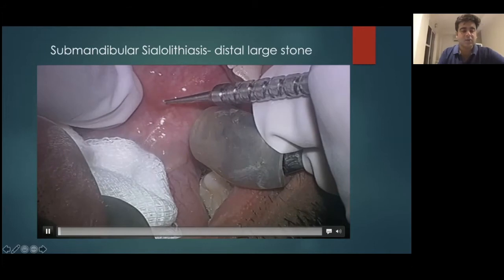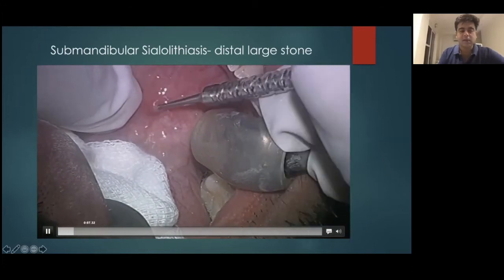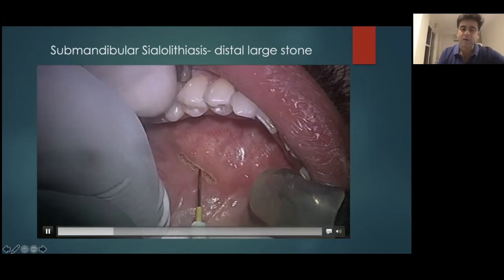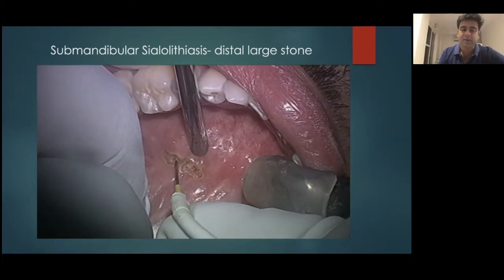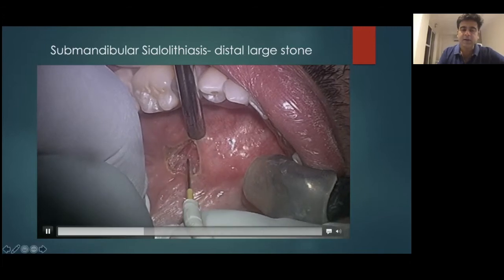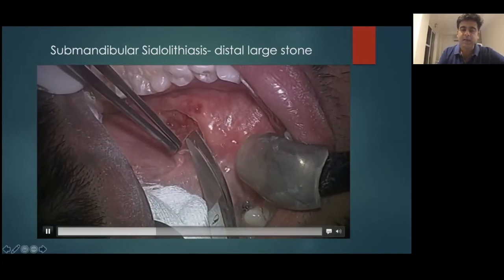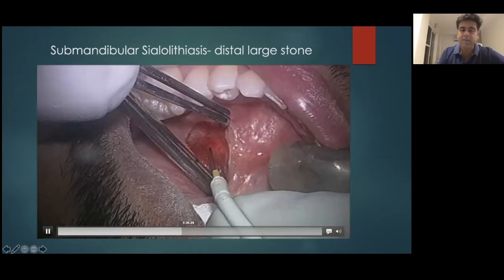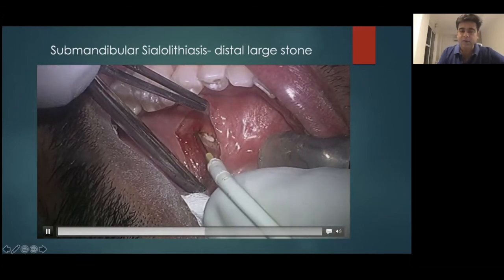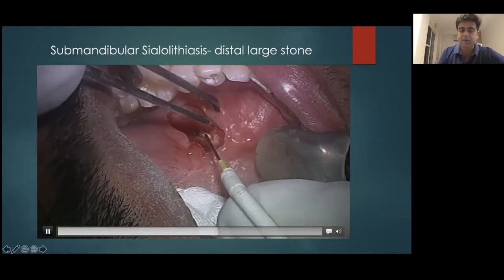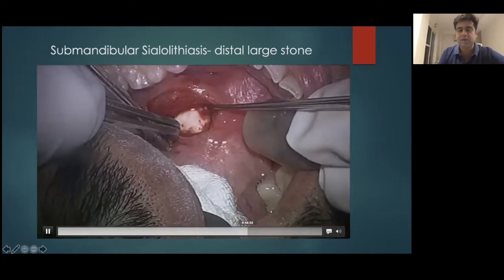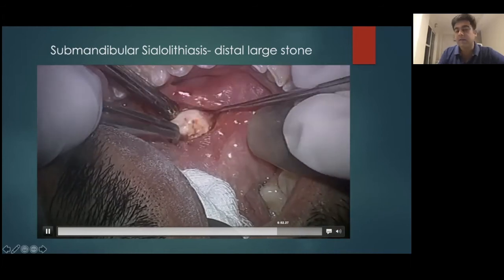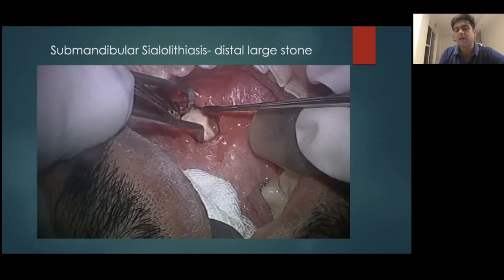For a distally placed large stone, the sialendoscope is not really necessary — you just give a stab incision. But what we sialendoscopists really propagate is to preserve the sublingual gland. We give an incision between the sublingual crest and the floor of the mouth, dissect in a plane between them, and once below the sublingual gland — that's where the duct is — you reach directly above the duct and to the stone. This was a big stone with a lot of pus behind it, and incidentally there was another stone behind this as well, which without the endoscope we would probably have missed.